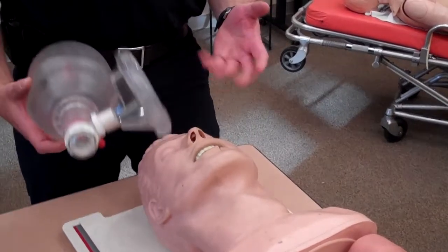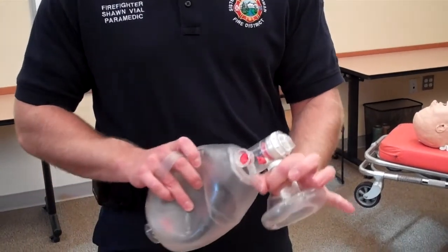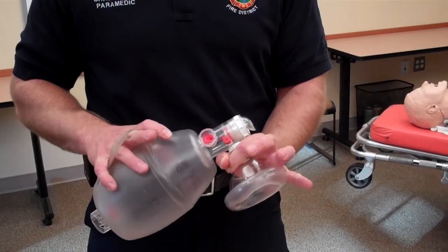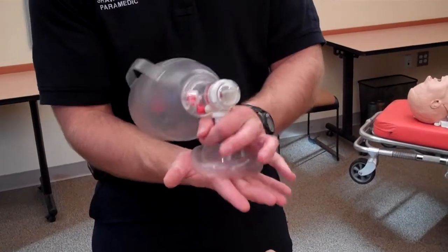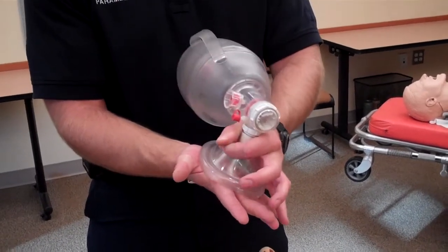What we recommend is using the OK technique — making the OK symbol with your hand. We want you to choke up really high on the 15-millimeter port with the BVM. What this will allow you to do is, basically just by rotating your wrist, apply pressure evenly all across the patient's face.